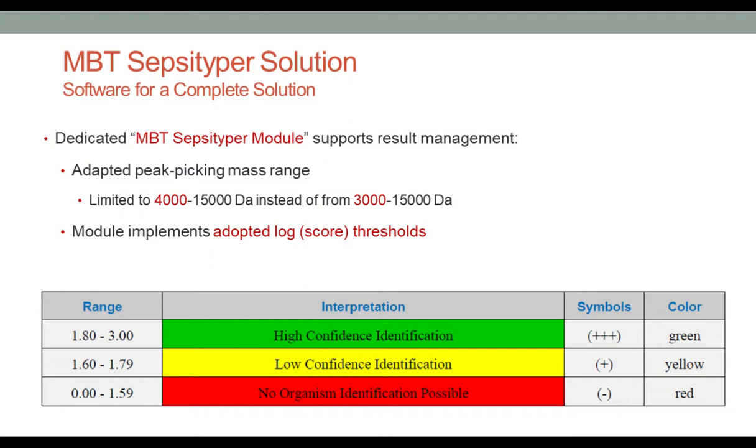We felt that we may delay them getting in the incubator, but on the backside we had more opportunities in a core laboratory setting to bring them all here and have more things that we could do in the core lab. Since we did have two different blood culture systems that we were using at the time, we did have to validate each blood culture system to make sure that they worked with this. And since they were all being done here in one laboratory, we didn't have to validate for each of the individual hospitals.